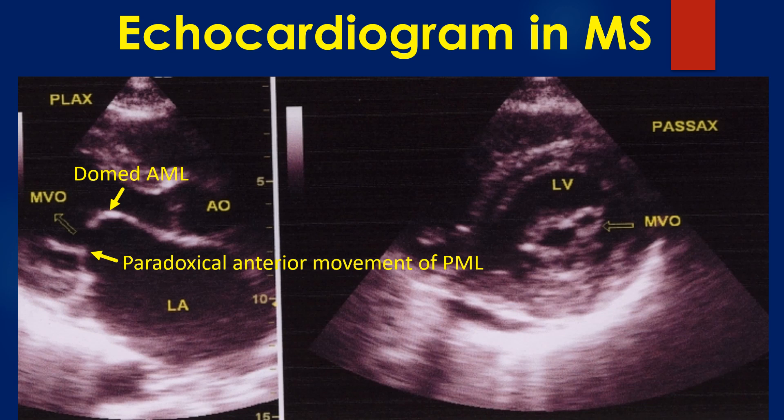Transmitral gradient is better assessed in the apical 4-chamber view by Doppler. Associated tricuspid regurgitation, if present, can be seen on the apical 4-chamber view, which will also help in estimating the right ventricular systolic pressure from the TR gradient.